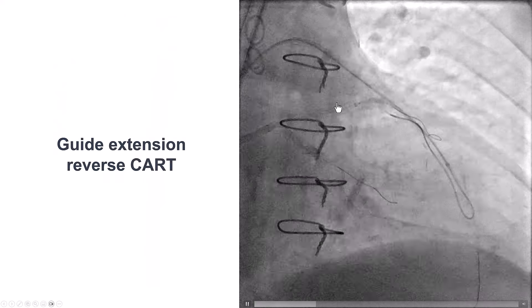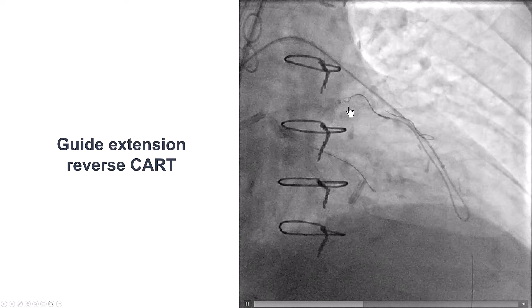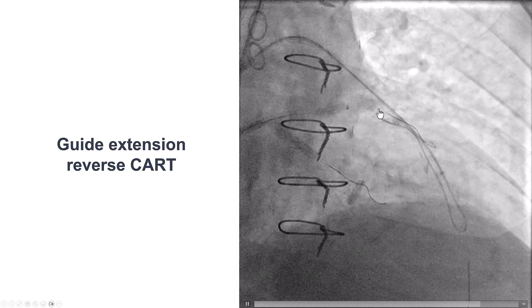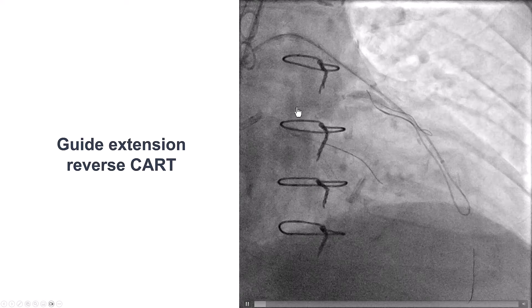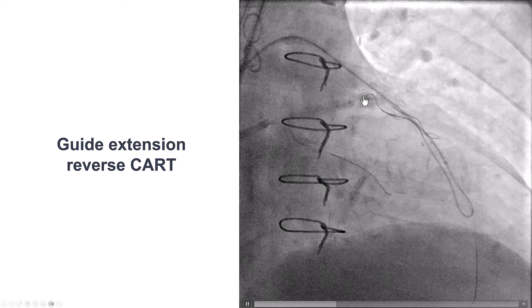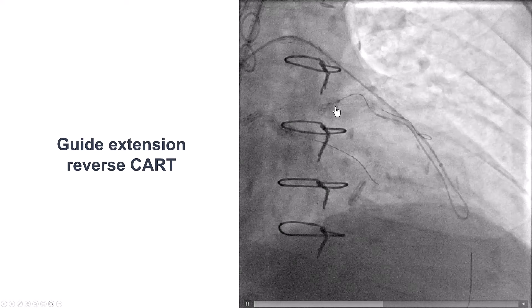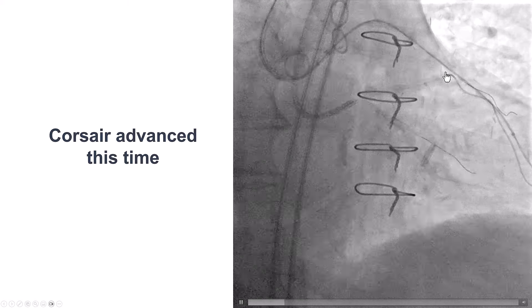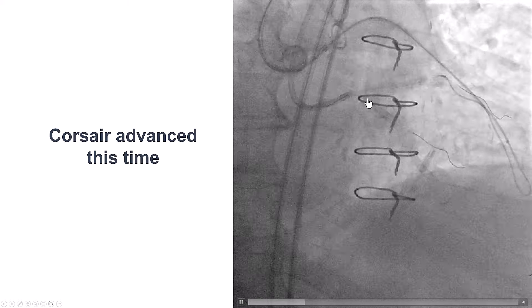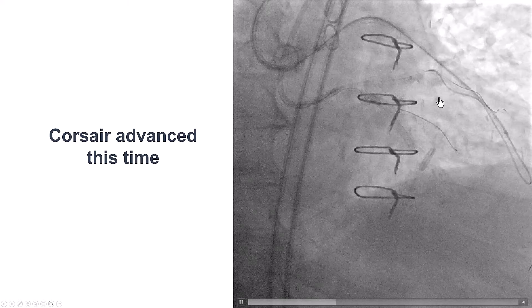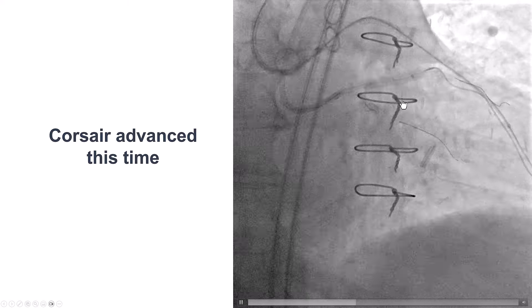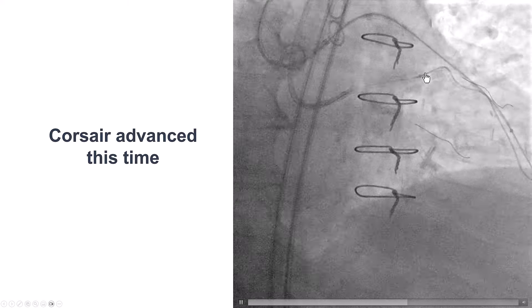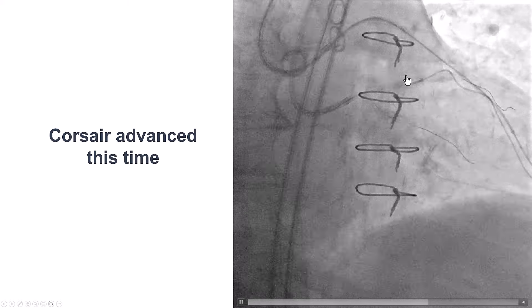We inserted a guide extension in the antegrade direction. Using the standard guide extension reverse CART technique, we were able to advance the retrograde guidewire inside the antegrade guide catheter. In contrast to the previous attempt where we could not get the retrograde microcatheter to advance, this time we were able — likely because we used a different re-entry point — to advance our retrograde Corsair into the antegrade guide extension.